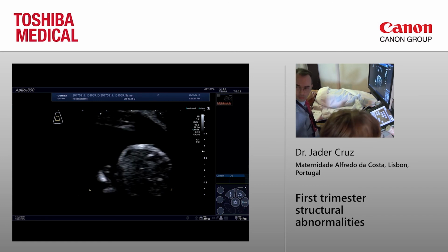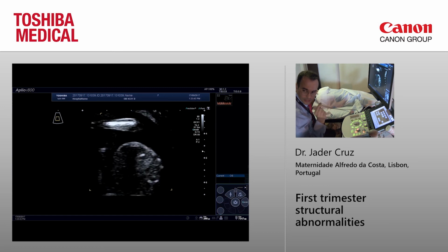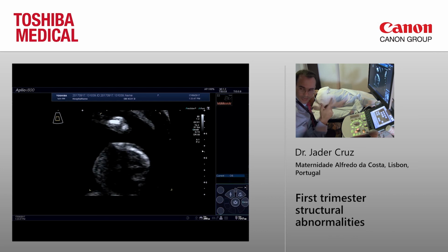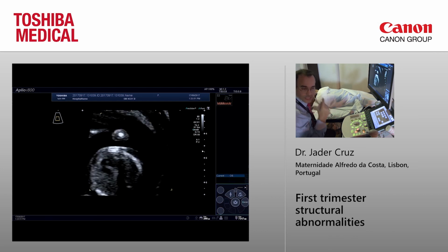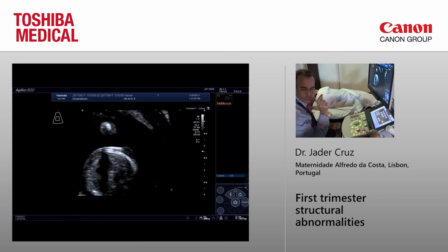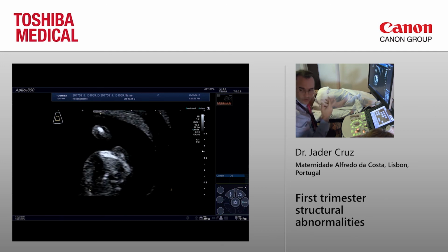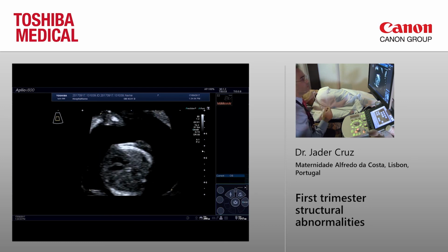For trisomy 21 or chromosomal abnormalities, what we use nowadays is the PI. Yeah, the higher the chance. By using the PI, you increase a lot your detection rate. The PI of the ductus venosus on its own, as a marker, as a screening test, has a 60% detection rate. So it's really, really important, the PI.